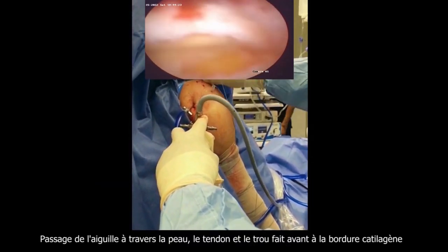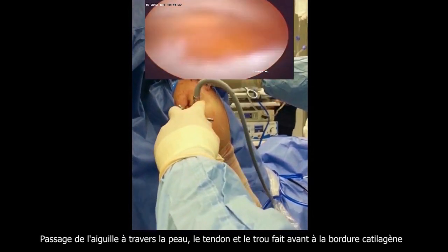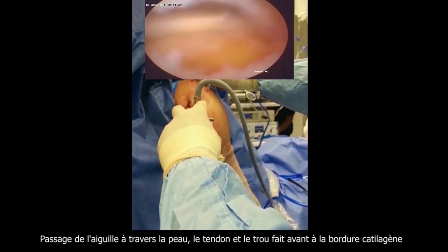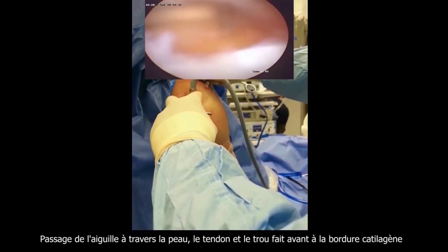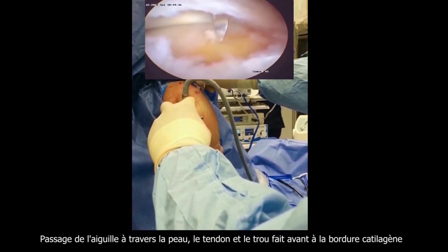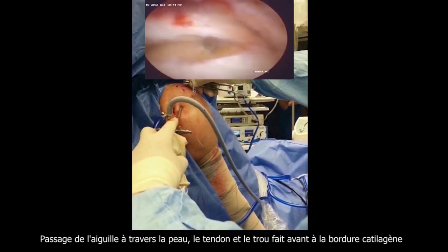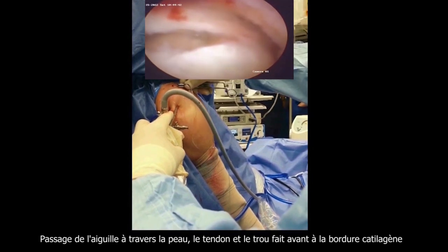Here we see the giant needle is passed through the skin anterior to the acromion, then through the torn tendon 1 centimeter medial to its edge, and pushed in the hole made before by the awl at the junction between the cartilaginous head and the footprint area.